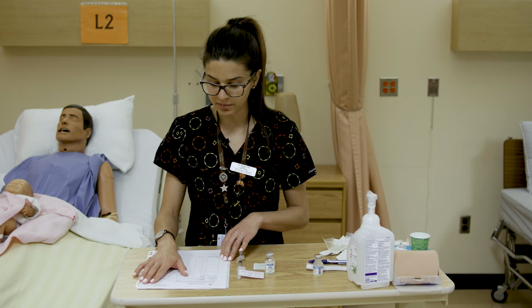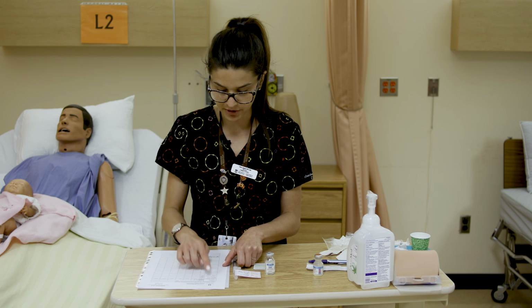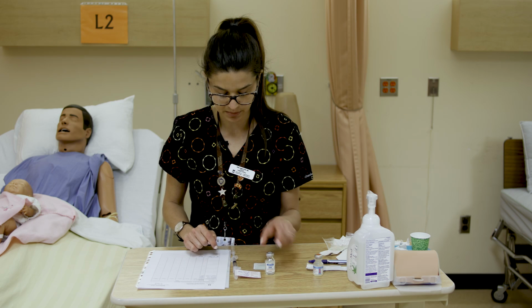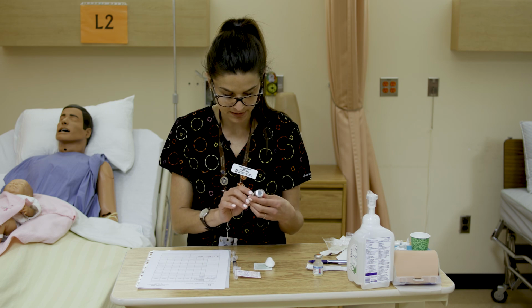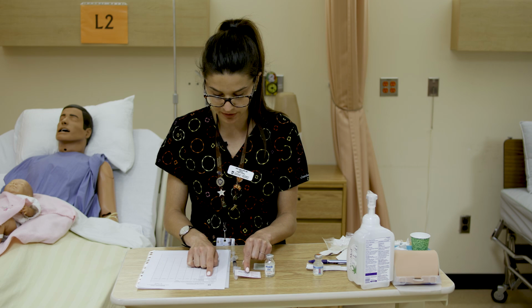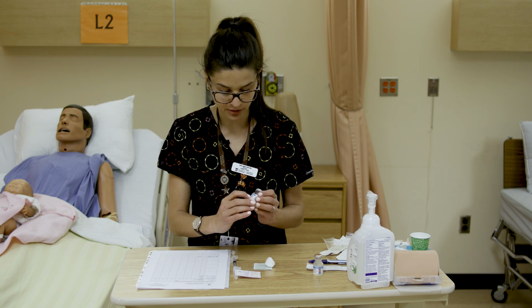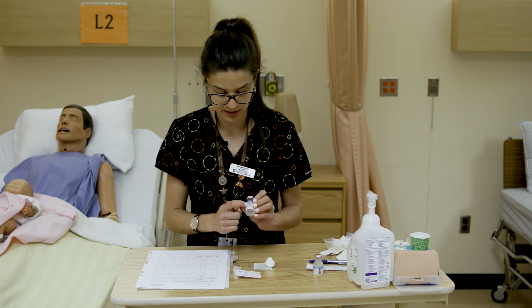And we're going to review our MAR. So we have the right patient, Chris McPherson, on our label. The drug name again is ampicillin, and ampicillin is in fact where we took it from. The dose is 500 milligrams. So we have 500 milligrams. This had a total dose in here of 1,000 milligrams.